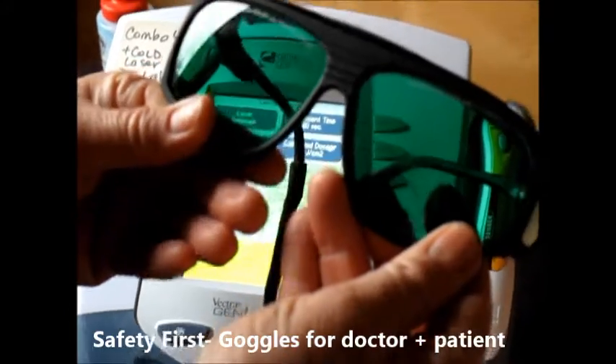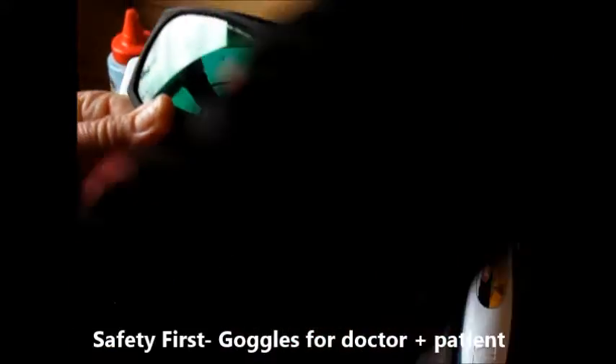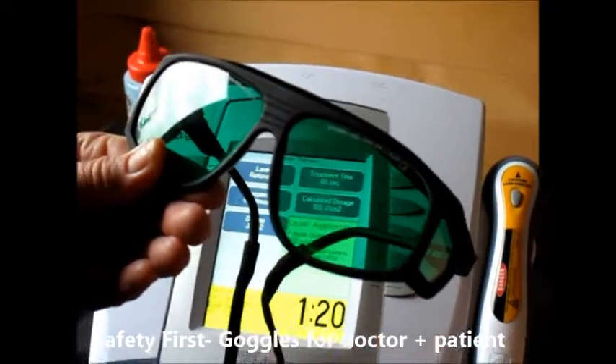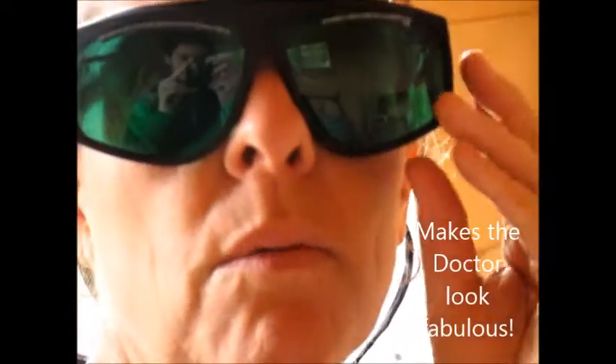These are special glasses that are designed to protect the eye from any laser escaping from the treatment and perhaps hitting something like a reflective surface and coming back to damage the eye. So here I'll put mine on. You can see how gorgeous one can look with glasses on.